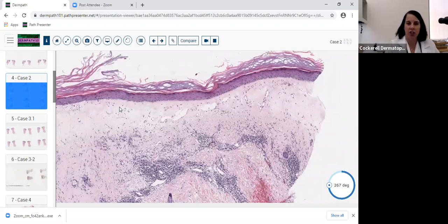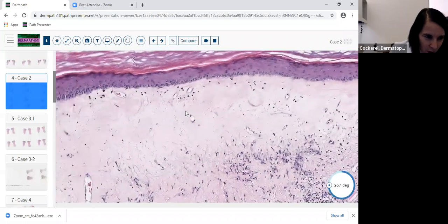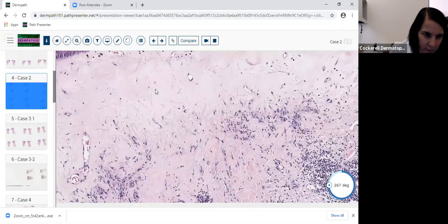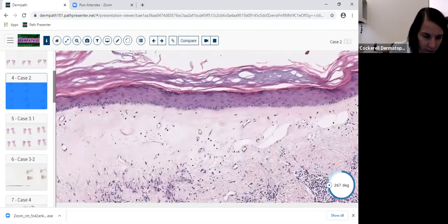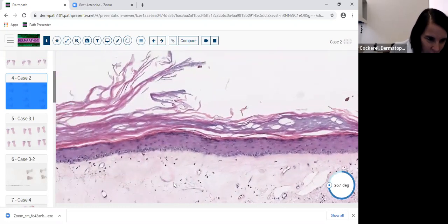So it is important to look at this epidermis and make sure there's no squamous cell carcinoma in situ. But don't overcall this. Don't say, oh, there's mild dysplasia here. Don't do that. This is not dysplasia here. This is atrophy of the epidermis. And again, look at your keratin layer. You don't have any parakeratosis here.